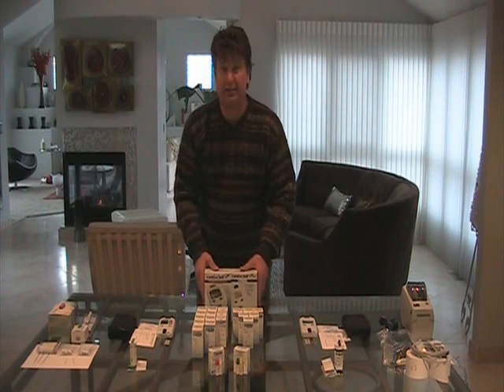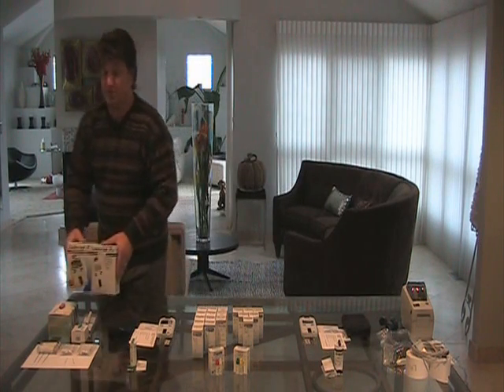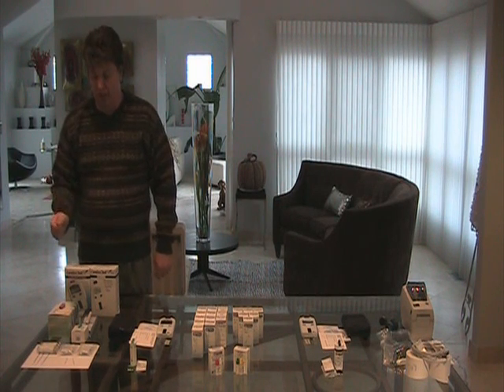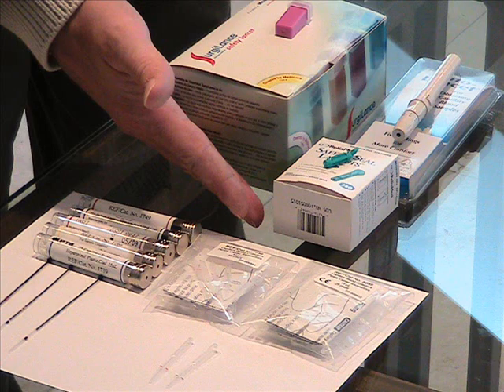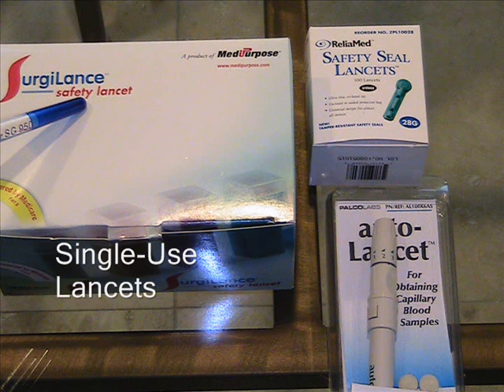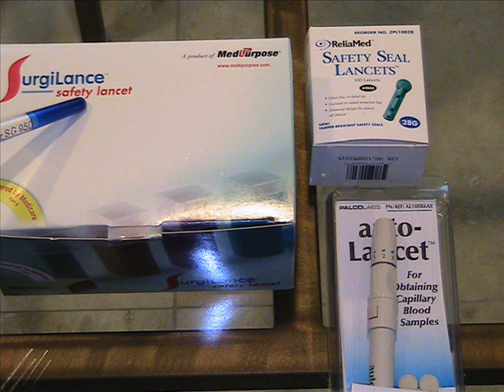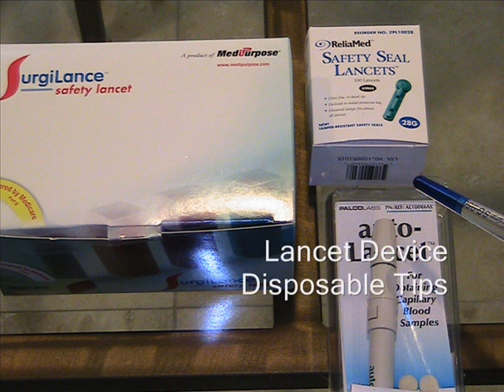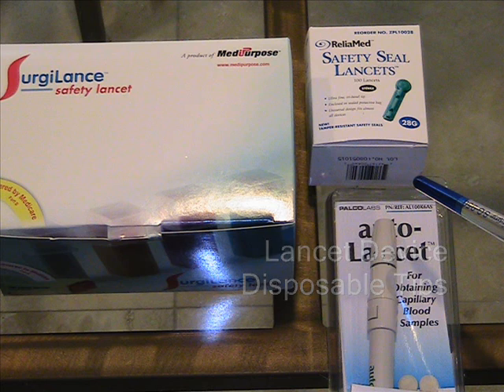Both of these tests require some supplies, and in particular you at least need 2 supply items. You need lancets and you need capillaries. Lancets is what you use to prick your finger. We have 2 types. We have what's called a single-use disposable, where you use the device one time, it pricks your finger, and then you throw that away. The other one is a lancet device, and then you put disposable tips in it and you throw the tips away.